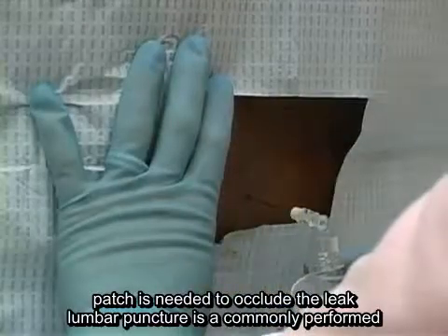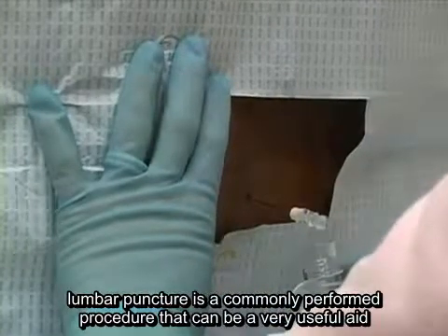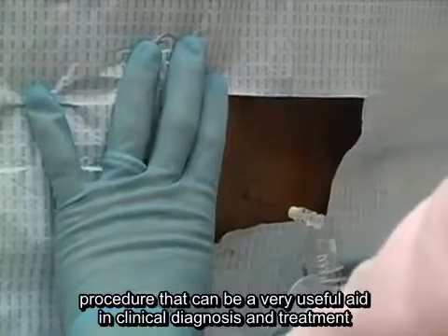Lumbar puncture is a commonly performed procedure that can be a very useful aid in clinical diagnosis and treatment.